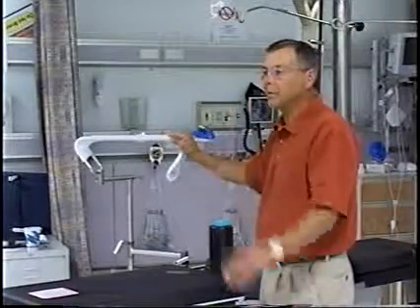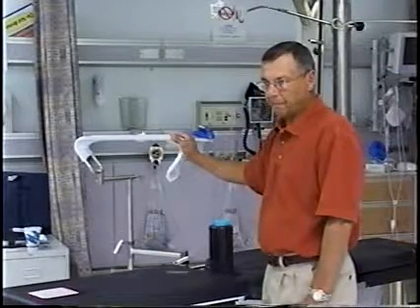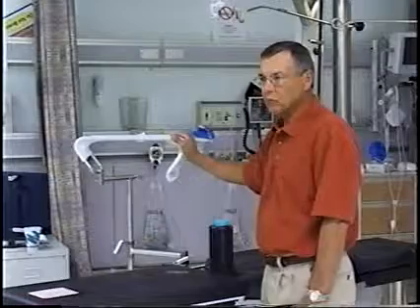And it varies from hospital to hospital. But they come with the Bucks boot. The Bucks boot works great. If not, we usually use foam padding.